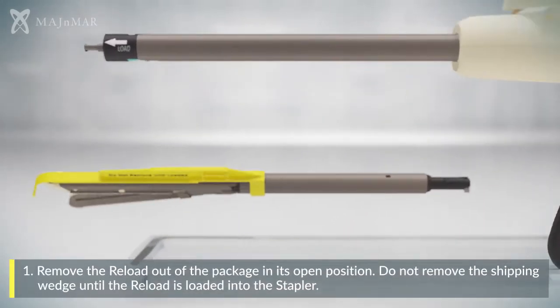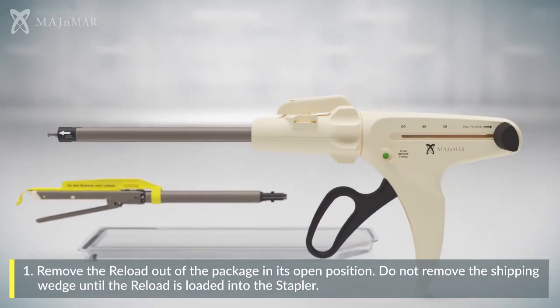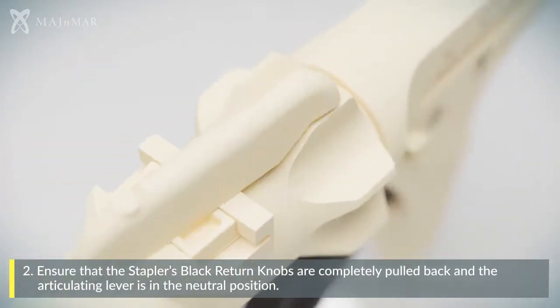Remove the reload out of the package in its open position. Do not remove the shipping wedge until the reload is loaded into the stapler. Ensure the stapler's black return knobs are completely pulled back and the articulating lever is in the neutral position.